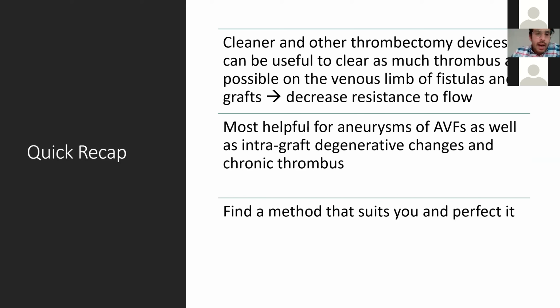But just a recap of what we talked about. Cleaner and other thrombectomy devices can be useful to clear as much thrombus as possible on the venous and graft sides, and that really decreases the resistance to flow. So again, it's that concept of shoveling the snow, getting the driveway as clear as possible. Again, I'm a believer in thrombectomy devices for accomplishing that.